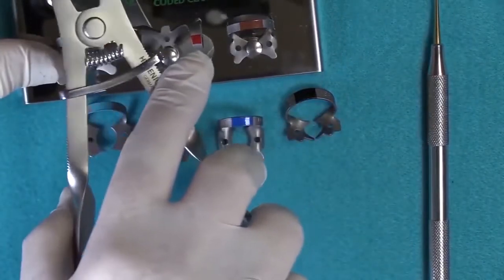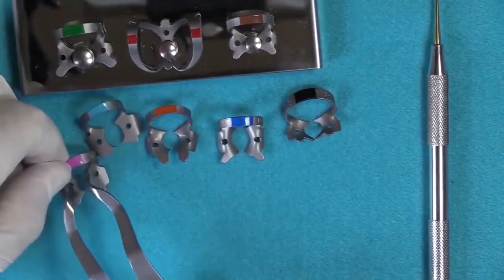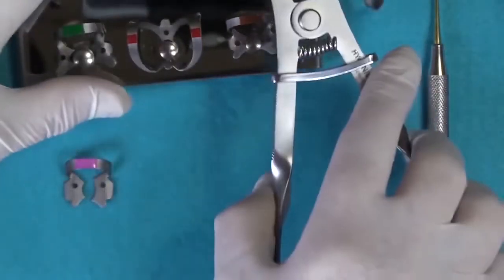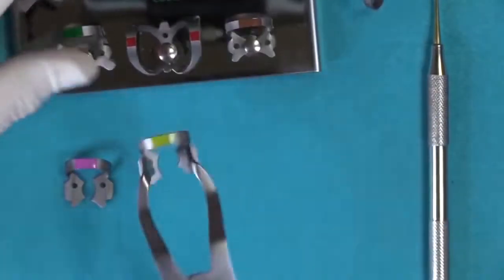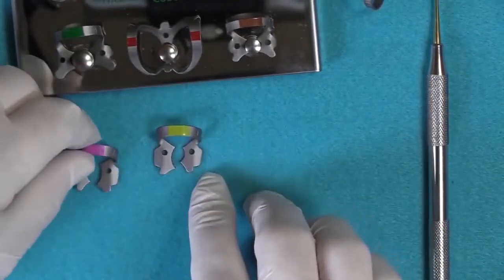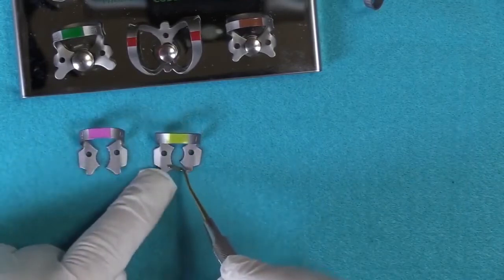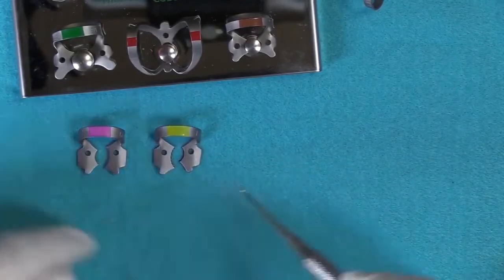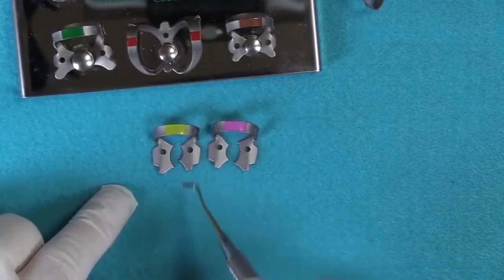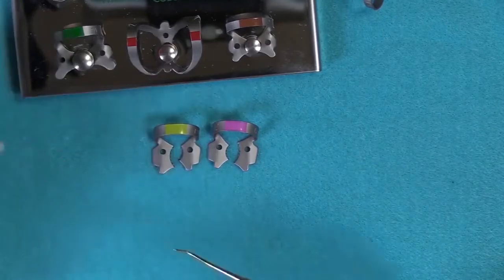One thing I did want to mention about the serrated jaw clamps, and you might notice some other clamps also feature the same situation, is that one side of the jaw is wider than the other. Can you see? This is wider than this side. Well, these are a paired set of clamps. By that I mean the wide side, or the bigger side, goes to the buccal aspect.